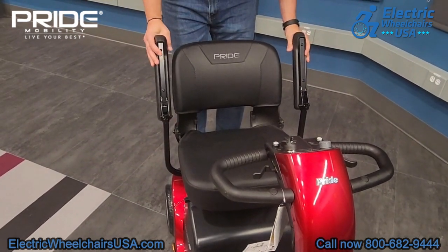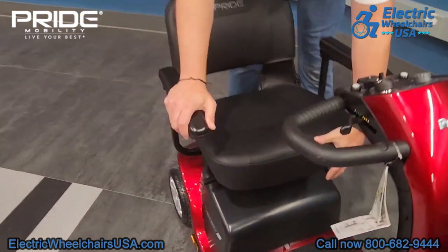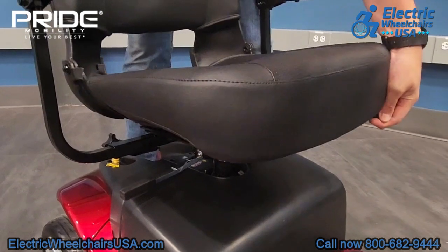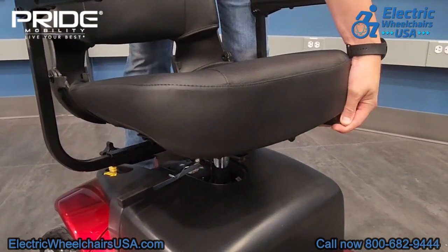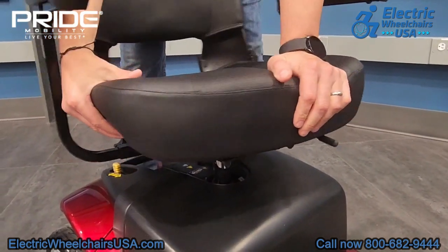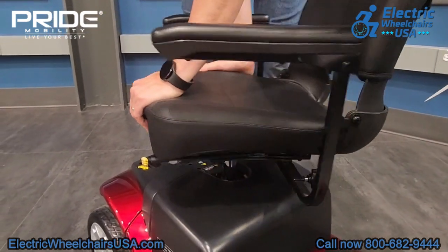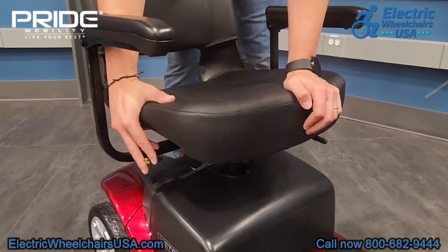The armrests do flip up so you can get in and out of the seat that way. Under the seat, there are two levers. There's one on the front of the seat — if you pull that up, you can slide the seat forward or backwards to get to a nice comfortable driving position. There's also another lever on the right side of the seat, and if you pull that up, the seat will swivel to the side. It actually swivels 360 degrees, so that's another easy way to enter and exit the seat.